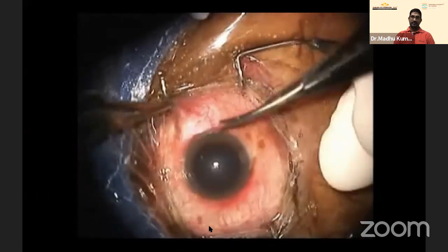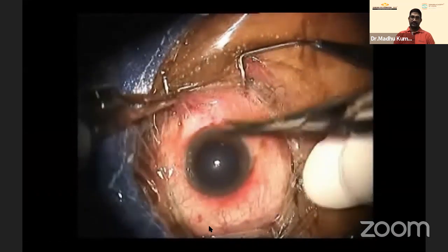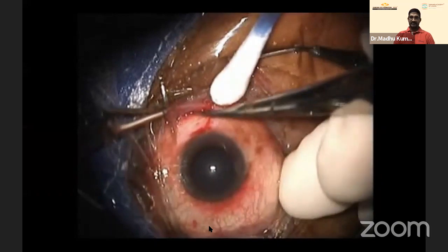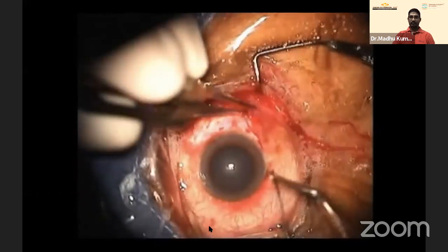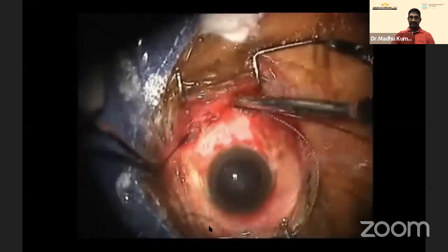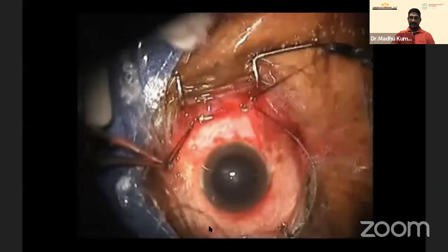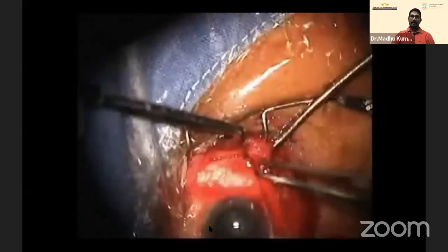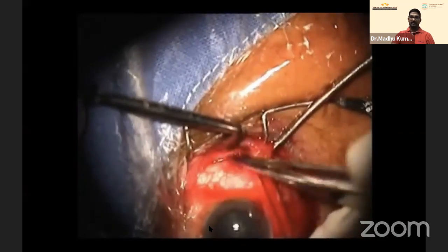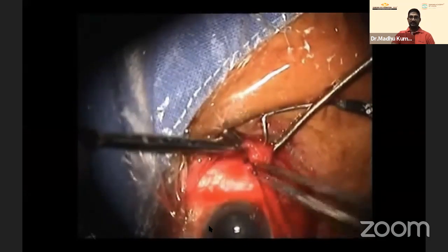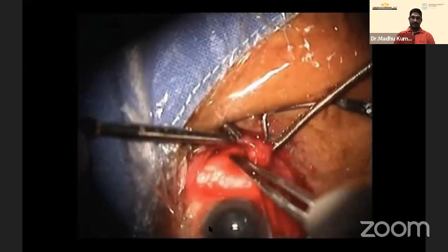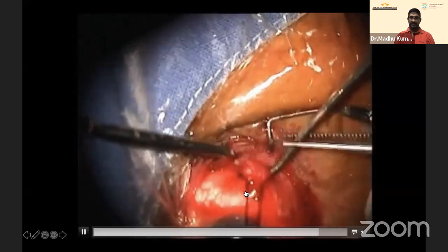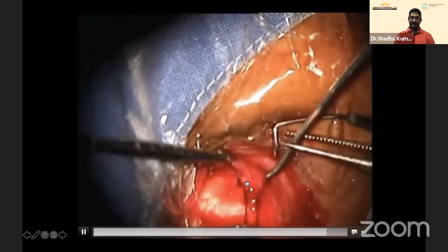On exploration, the patient was taken for single-step surgery. The plan was to repair the scleral tear with primary repair along with vitrectomy, as the globe was formed. The tear was found sitting just behind the inferior rectus.